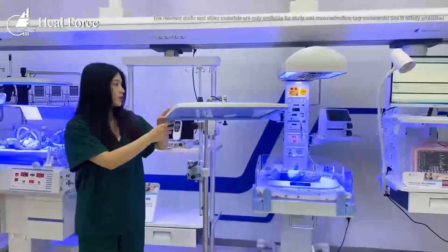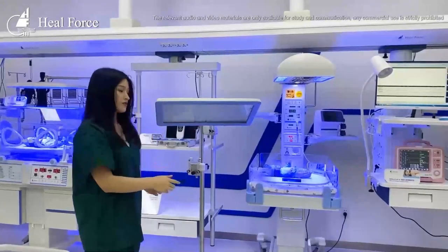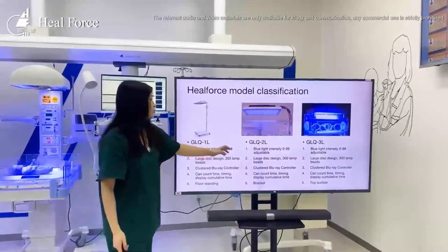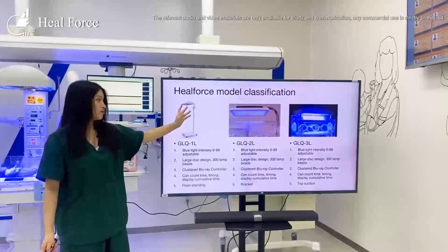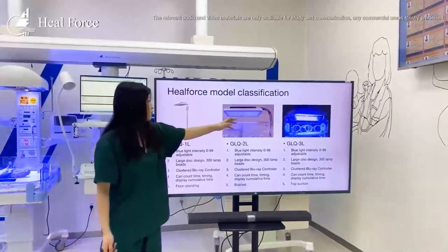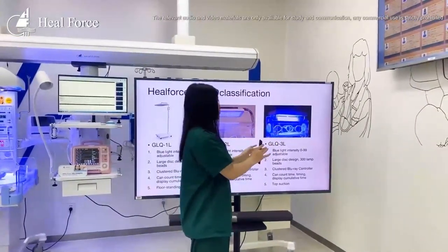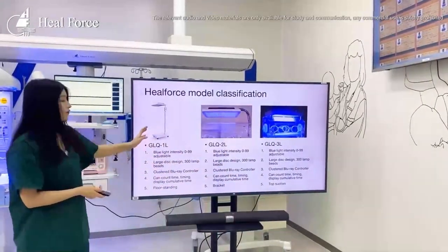This machine also comes in different types — we have three models: the GLQ 1L, 2L, and 3L. The blue light beads are the same across models, but the use cases are different. The 2L can be used with an incubator by inserting it in, while another model can be placed directly on top of an incubator. After treatment, you can simply move it away. This is how our phototherapy unit works.